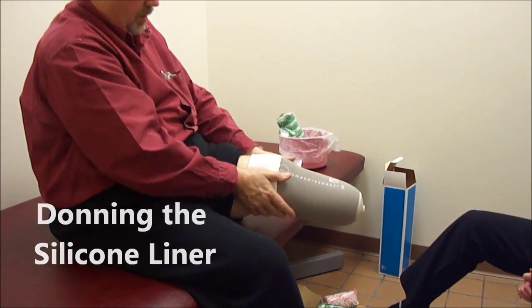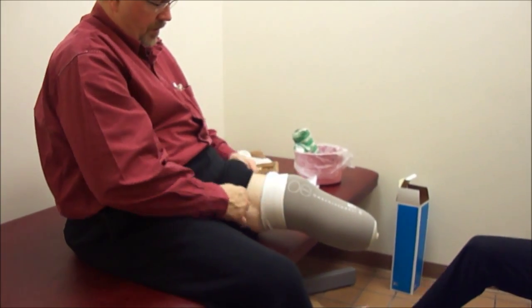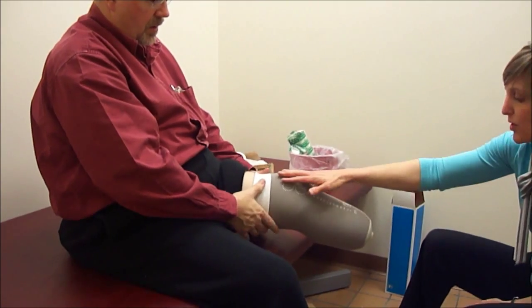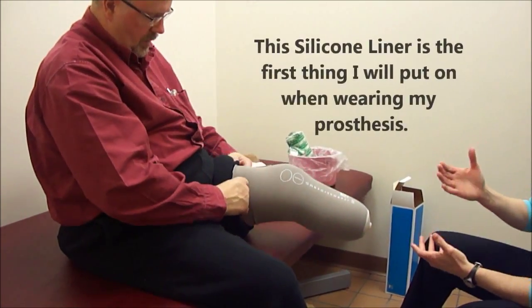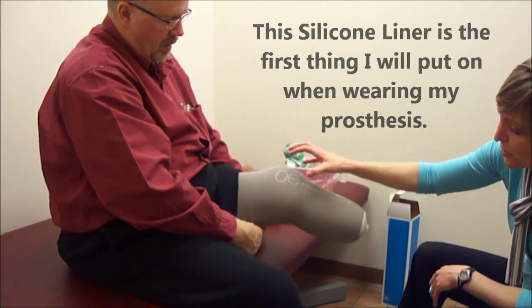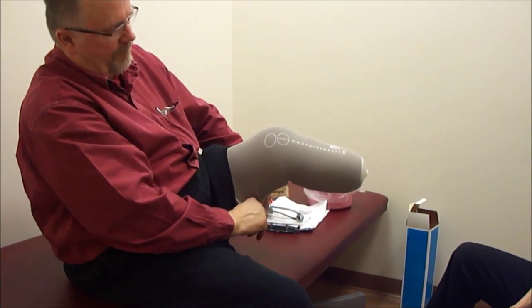Looks very good. It doesn't matter that the words are off? No, it really doesn't. I'm in the habit of putting the words in the front of the leg like this. The only advantage to putting it on the same way every time is that this will start to conform to your knee a little bit, so it'll almost be a little bit pre-flexed after a while.